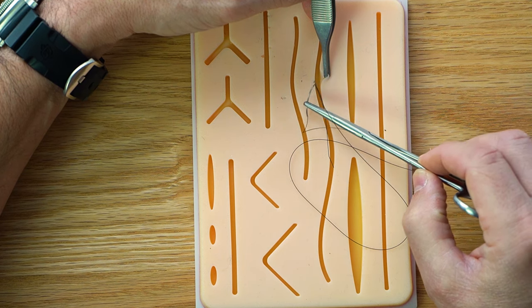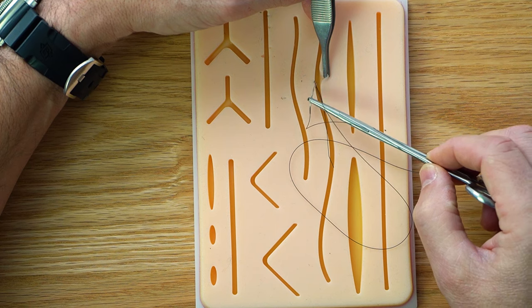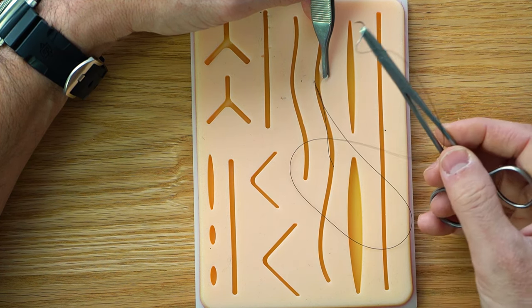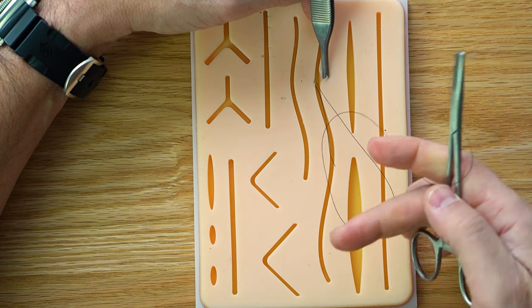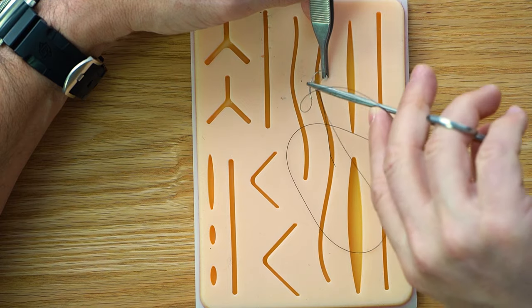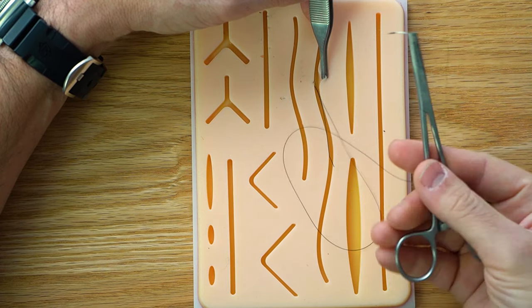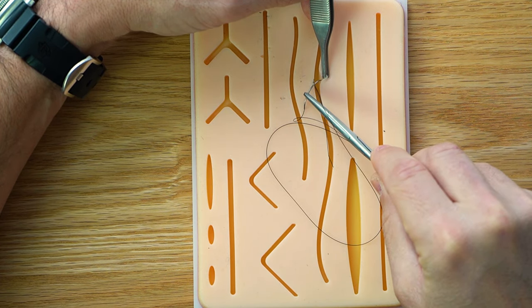I'm gonna find now the place I wanna go in, and note the place you wanna go in is exactly the same depth of the place that you came out over here. And also notice how I have this needle driver, I'm not keeping it like this. Okay, to put in, it's much harder. So I take the needle driver and I flip it around in my hands, and look, I have it like this, okay? Way, way easier.